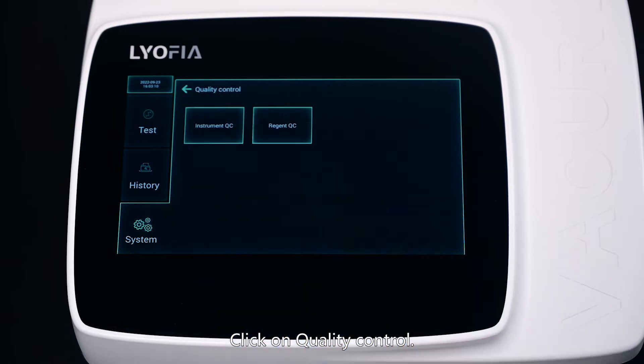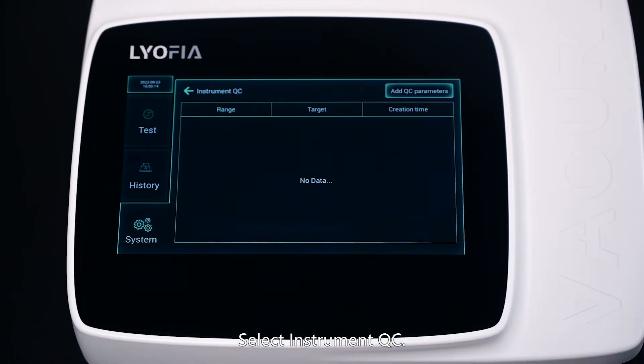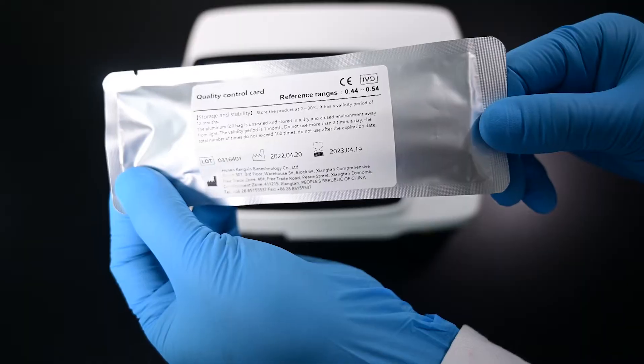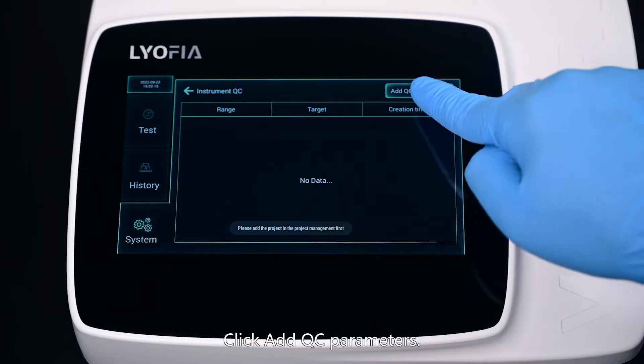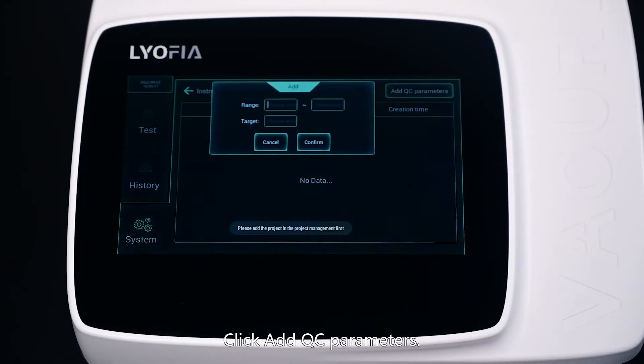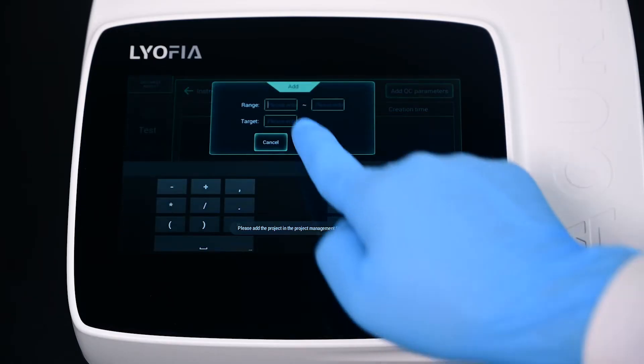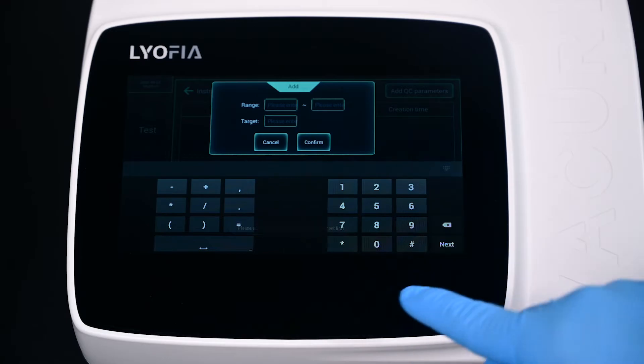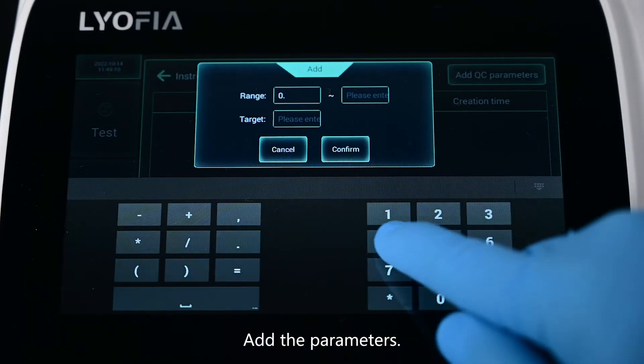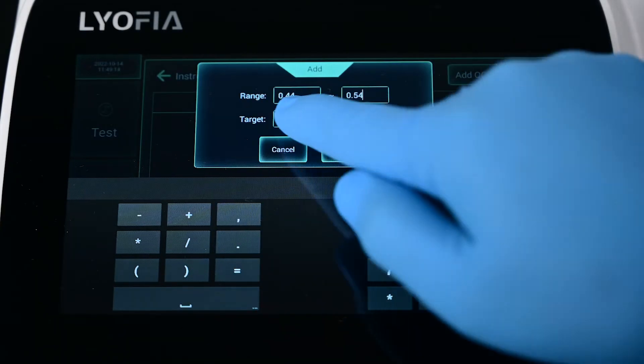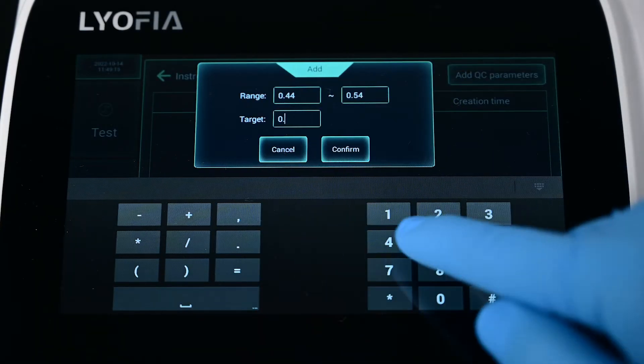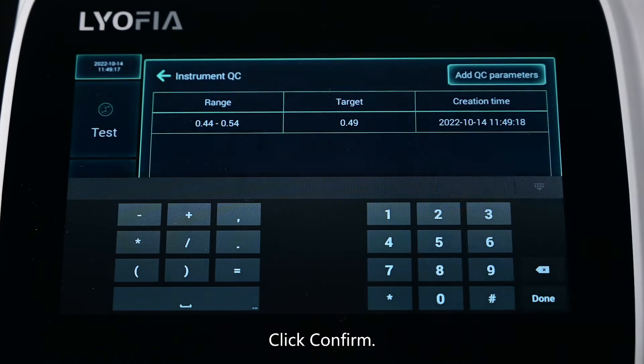Click on Quality Control, then select Instrument QC. Click Add QC Parameters, add the parameters, and click Confirm.